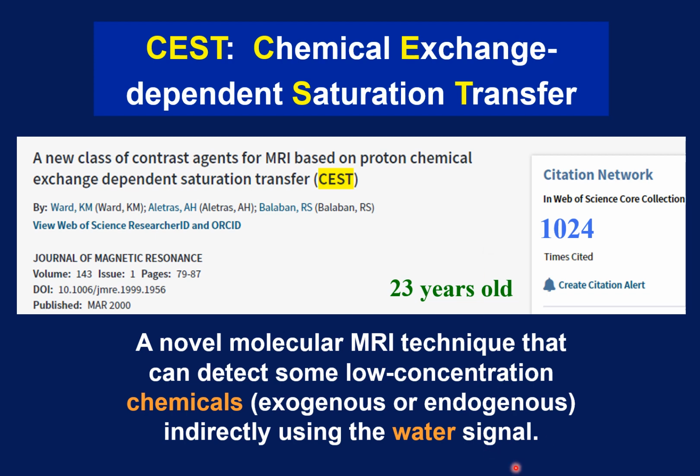CEST imaging is a molecular MRI technique that can detect some low concentration chemicals, exogenous or endogenous, indirectly using the water signal. The important thing here is that our MRI scanners are designed to detect water. Now, you can use the same MRI scanner to see something else.